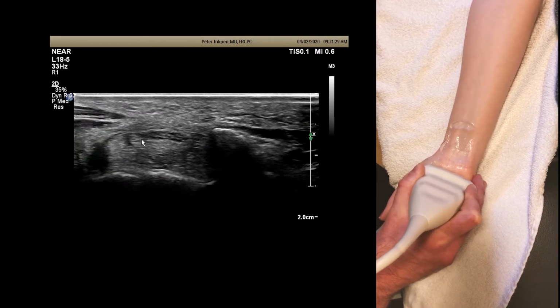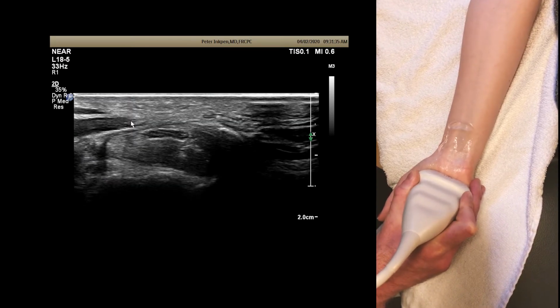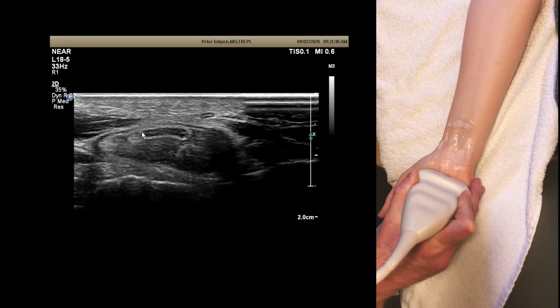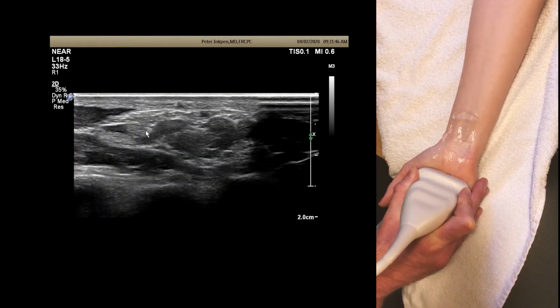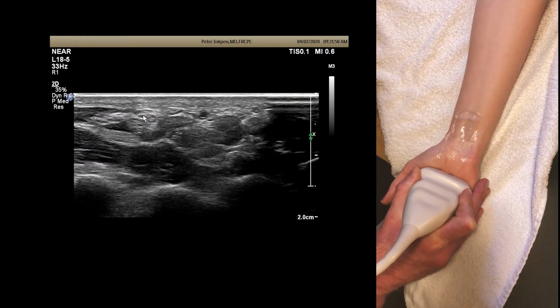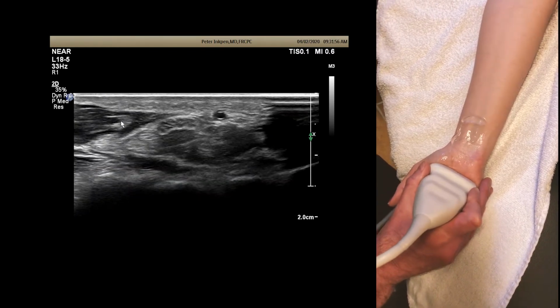We get to the distal aspect of the carpal tunnel, and things flatten out. This is a normal flattening. The carpal tunnel generally flattens out in normal individuals. And then the median nerve will rise superficial just a bit and then start to split and branch. And the median nerve will branch into multiple fascicles that end up going to the digits and into the thenar group itself.